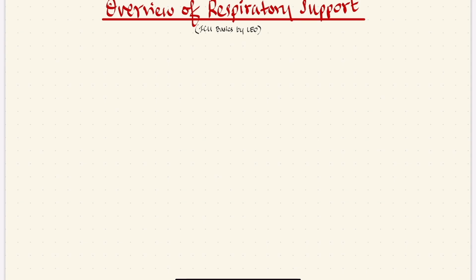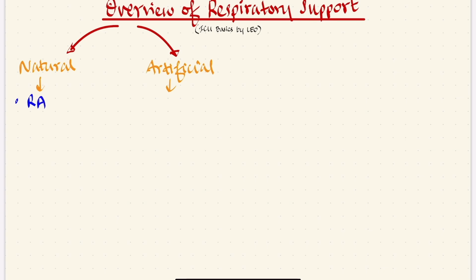In this video, I would like to discuss how to support patients' ventilation on intensive care unit. Basically, we can assist patients' respiration via natural airway and artificial airway. Some patients who are admitted to ICU for other organ support may not need any ventilatory support. In such patients, we should keep them on room air, without providing any supplemental oxygen, which could be a way to support and maintain a patient's oxygen saturation in a suitable range, for example, 88 to 92% in patients with chronic type 2 respiratory failure like COPD.